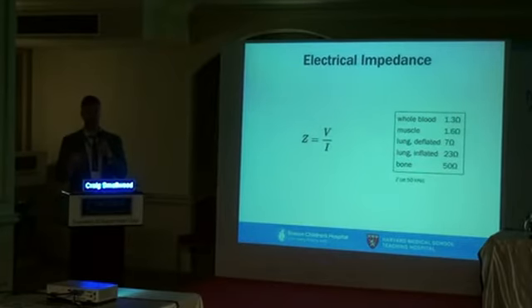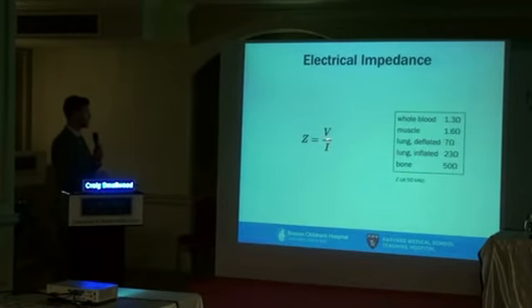It can flow through tissue and water much more readily than it can air. So that's basically the impedance. So that's the principle that we're leaning on to get these images. And Z here is the electrical impedance, voltage, and amps. So you apply a current, measure the impedance at a given voltage, and that's essentially the crux of it.